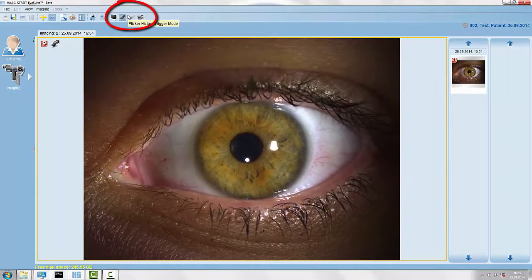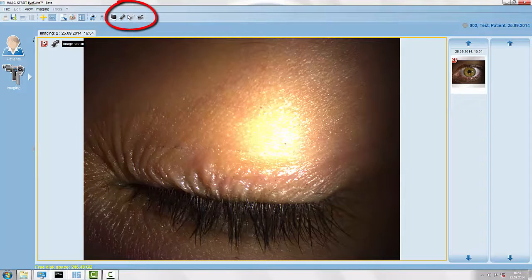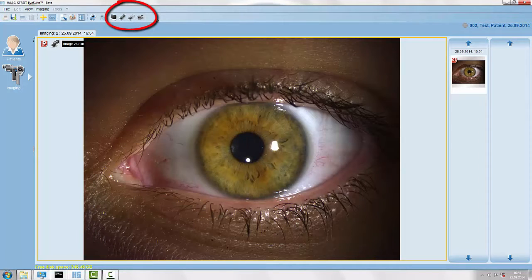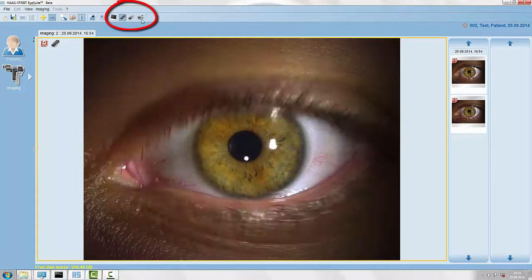Here we freeze the image any moment, but as our patient just blinked we now can go back frame by frame until we have the perfect image.